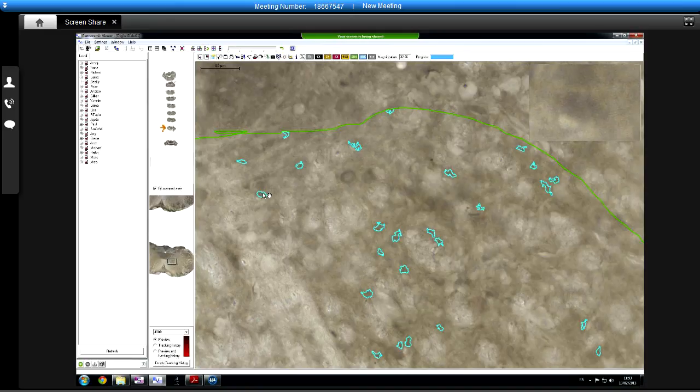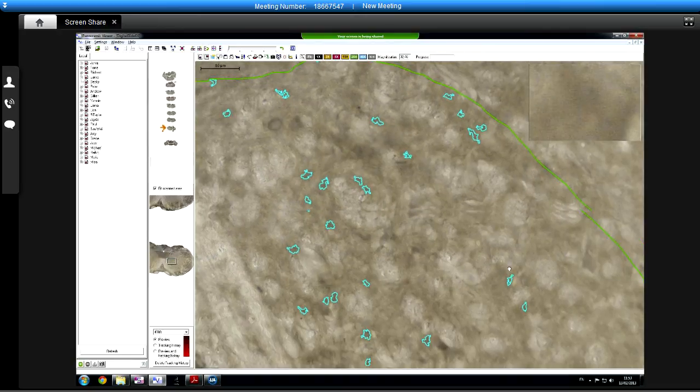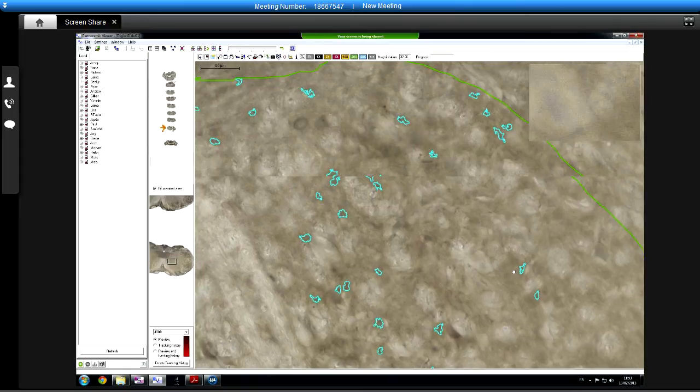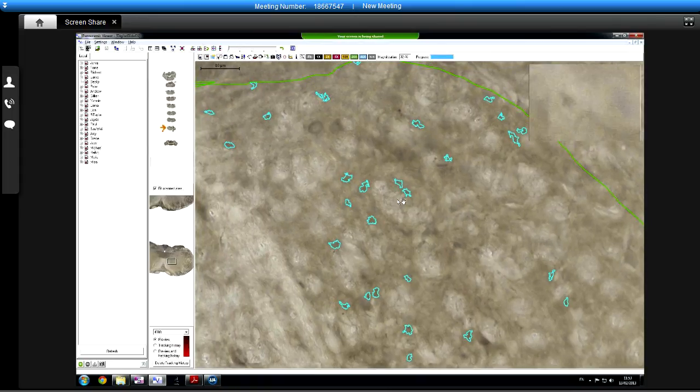Okay, so what do we do about tweaking? One of the ways I think is quite useful is if you click on this one here, the little graph, which is measurement visualization. What this allows you to do is a number of things, but one of them is particularly useful from the tweaking point of view.